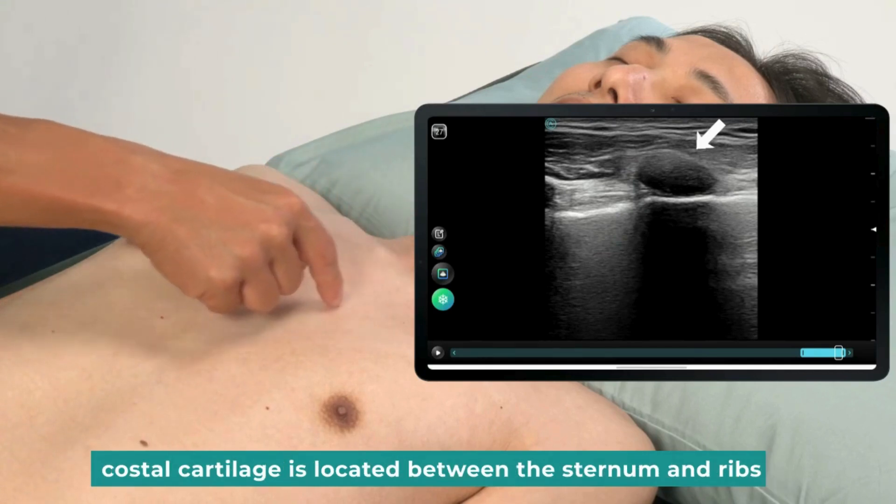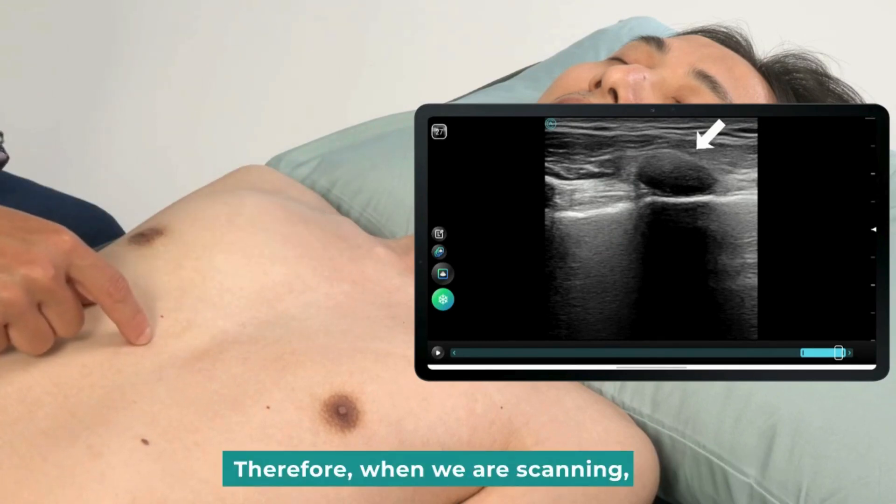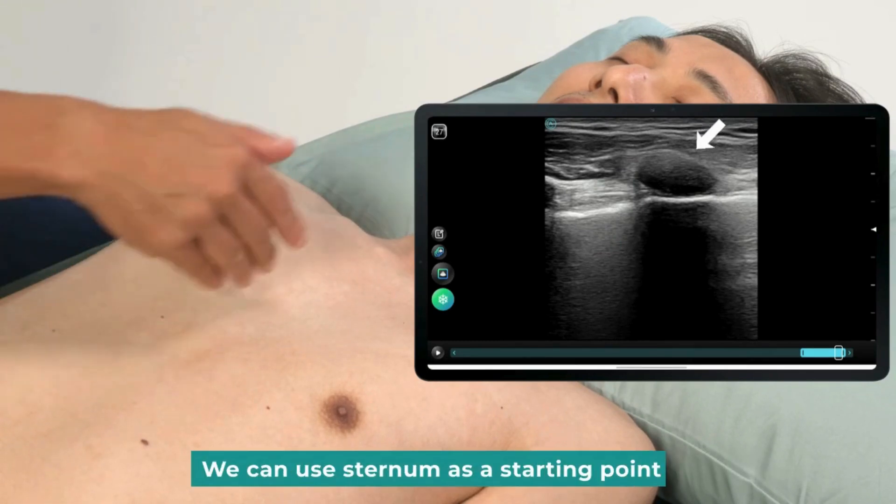Costal cartilage is located between the sternum and ribs. Therefore, when we are scanning, we can use the sternum as a starting point.